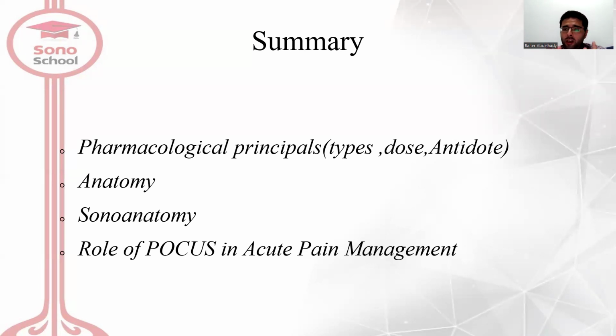This patient is a real patient I met here in the OR, and before spinal anesthesia, I gave her a femoral block, 10 ml lidocaine 2%. Then the patient could sit. I gave spinal anesthesia, and after the end of the procedure, I gave her a fascia iliaca block. Fascia iliaca block blocks the obturator nerve, femoral nerve, and lateral femoral cutaneous nerve and covers the thigh. It is called a 3-in-1 compartmental block, but it is outside the curriculum of SonoSchool.